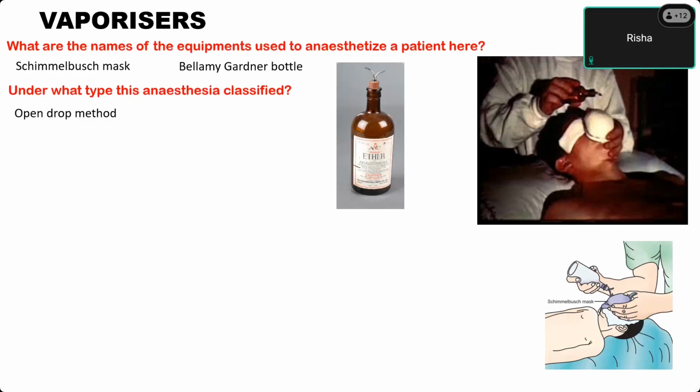Why so much delay in answering that? So he is breathing out again into the atmosphere and spreading the vapor to all of us. So if you give the open drop method, not only the patient will get anesthetized, after some time you will also feel anesthetized because you are also going to inhale some of the fumes.